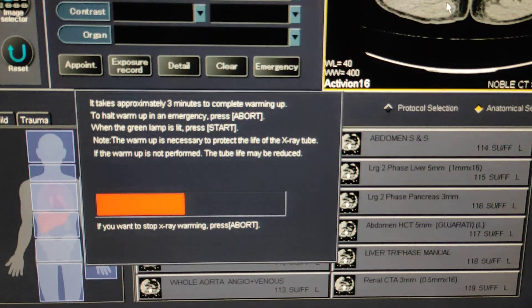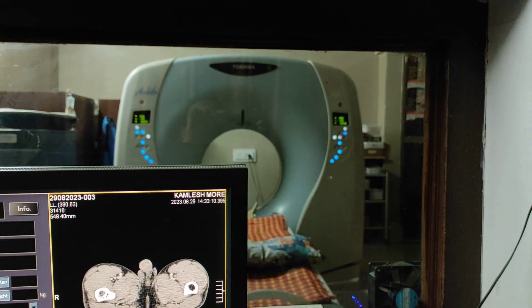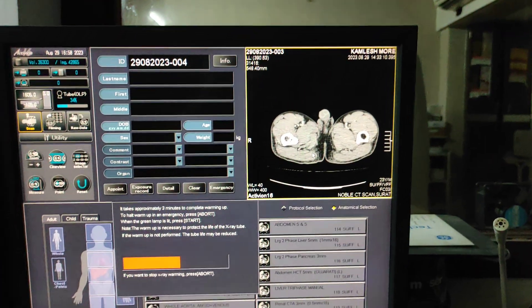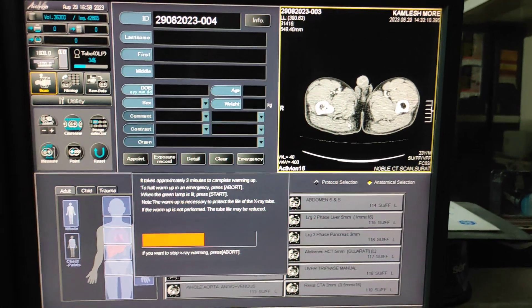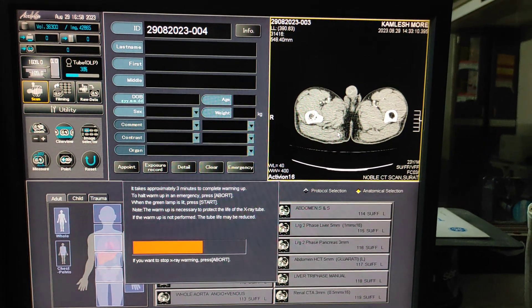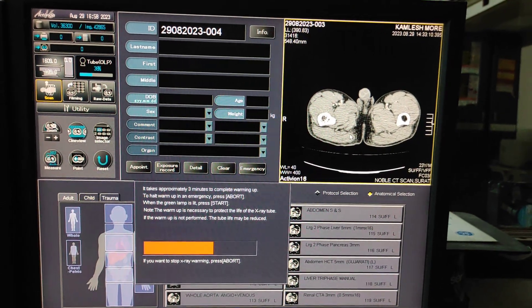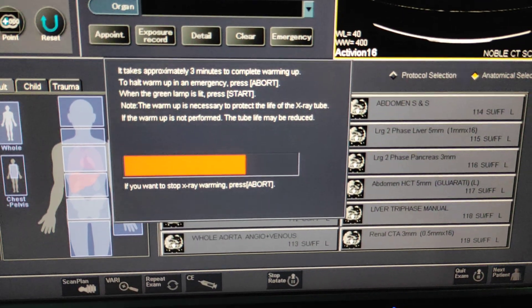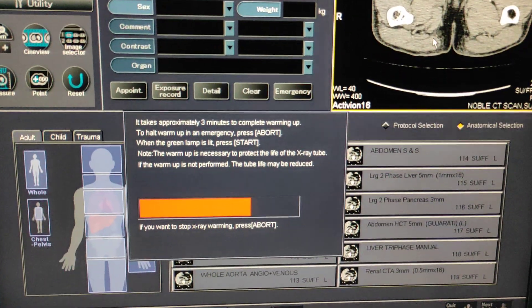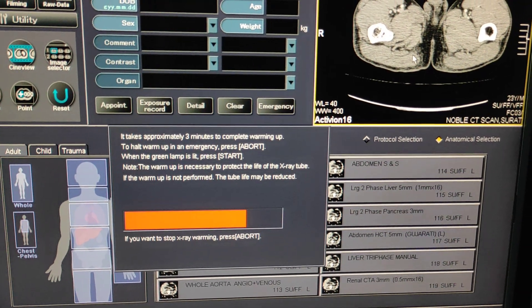You have to complete this process. This system is the Toshiba Activion 16-slice. If you take a scan without this warm-up process, the system will produce ring artifacts or other artifacts. So always take 3 minutes to complete the tube warm-up process before starting any scanning.